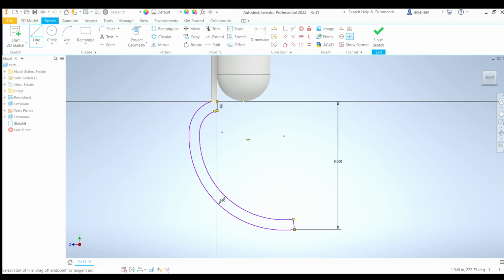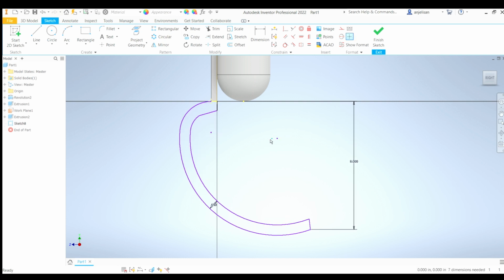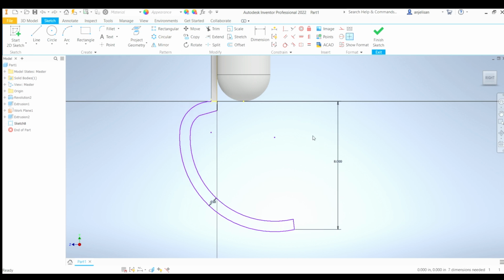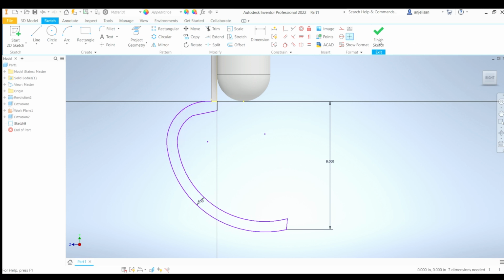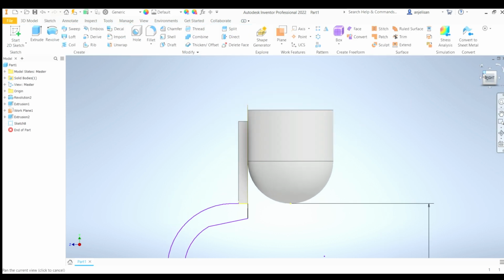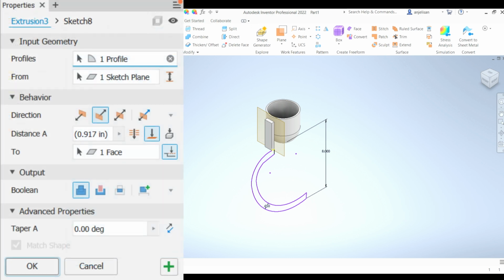Okay. Again, just adjust it as you see fit. Okay, so maybe I want this out more or something. Yeah. Okay, looks good. Now I want to extrude this, make this an actual 3D feature.